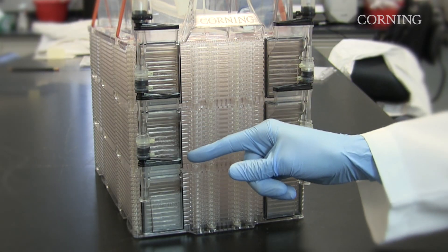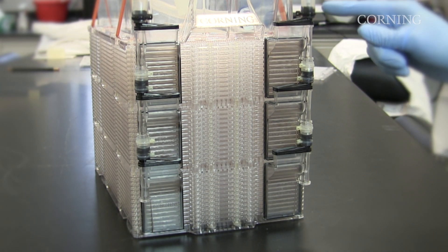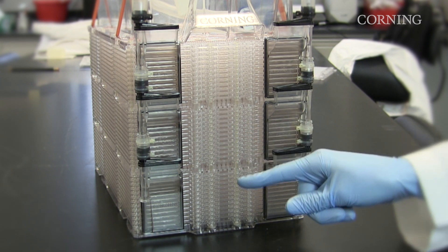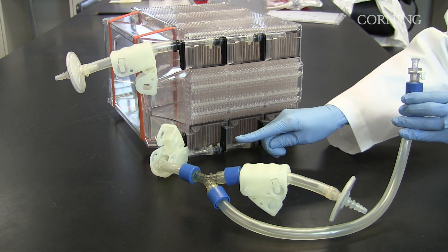The stackettes are connected by two manifolds to form a module. The Hyperstack 36 vessel has three modules with 12 stackettes in each module. Liquid moves in and out of the vessel through the liquid manifold.